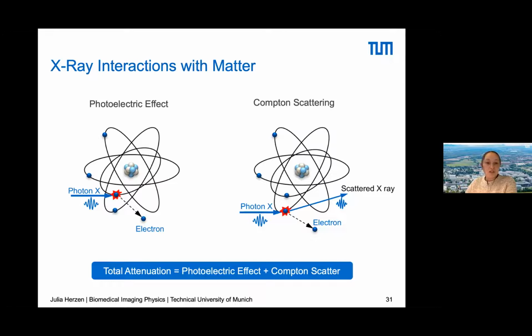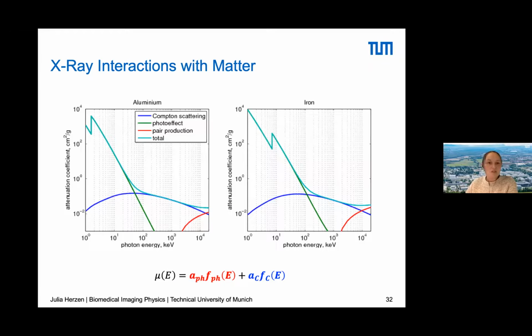So using the spectral aspect in the attenuation, you can distinguish between the photoelectric and the Compton distribution that is present in your image. And this is constantly used already in the clinics. And this is shown for 2 different materials here. For sure, you know that it's element specific and energy dependent. So for aluminum, for example, the photoelectric contribution is less than Compton for a special energy.